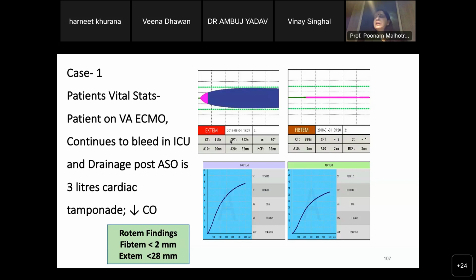But here we've done a platelet aggregometry, which is there from the blue box. So you attach 2 indicators, EXTEM, FIBTEM, and you've attached an ADPTEM and an ARATEM. This takes care of your adenosine pathway, which is for clopidogrel, and ARATEM takes care of your arachidonic acid pathway, which is for aspirin. So you have 3 of them, the thrombin pathway, which is TRAPTEM. You can choose your reagent depending, and we did this here. The platelet function is normal. Normal area under the curve, normal A6, normal slope.